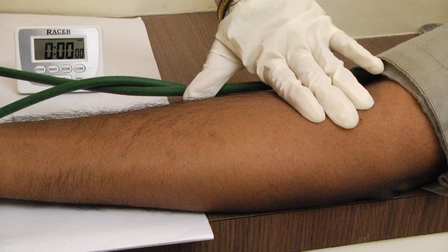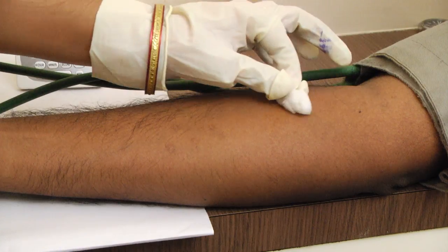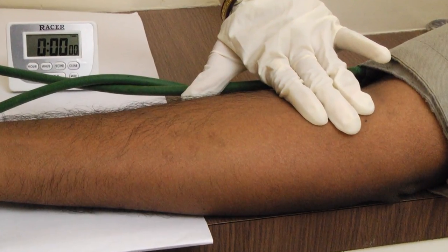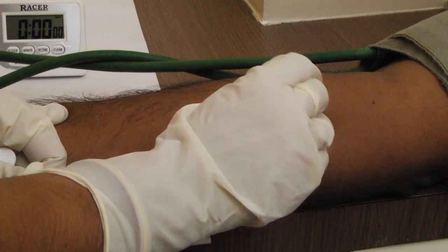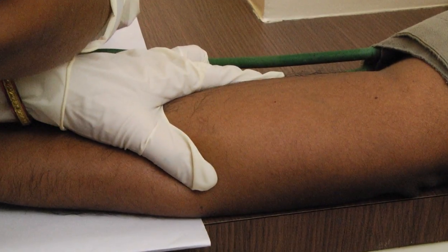Procedure: Place a sphygmomanometer cuff around the patient's arm above the elbow. Inflate to 40 mmHg and keep it at this pressure throughout the test. Clean the area with 70% ethanol and allow to dry. Select a site on the patient's forearm approximately 3 finger-widths below the bend in the elbow that is free of visible subcutaneous veins. A sterile disposable blood lancet is used to make two shallow incisions about 2-3 mm deep on the underside of the forearm.